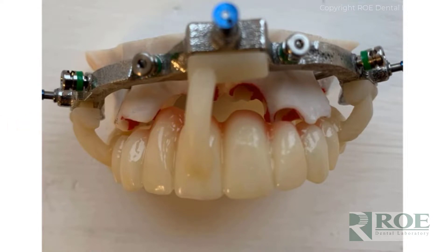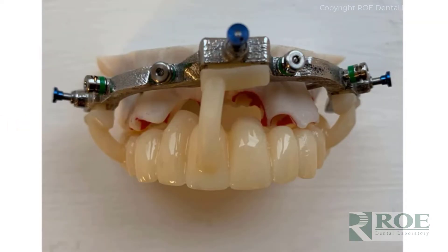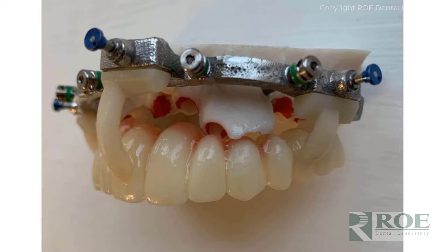This is what it should look like when the prosthetic is seated — we put a little pink on this one. There's also a rapid appliance: you always want to do the rapid appliance as a second pickup with all Chrome surgeries. We recommend doing a first surgical guide pickup and then the rapid appliance as a duplicate pickup. You'll notice this one looks like it's not fully seated because the plungers are out — the bone had to be reduced a little bit for the rapid appliance to seat fully.